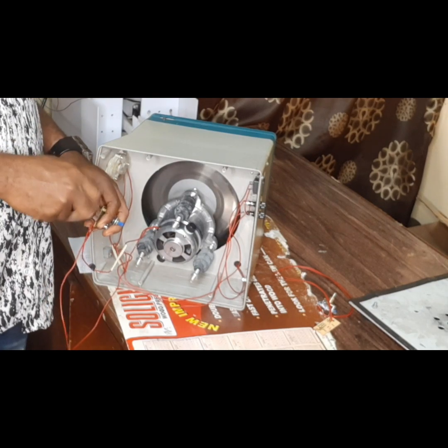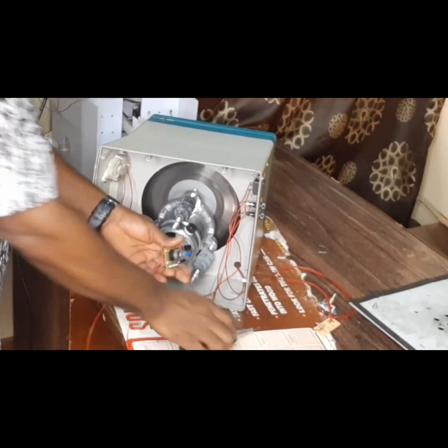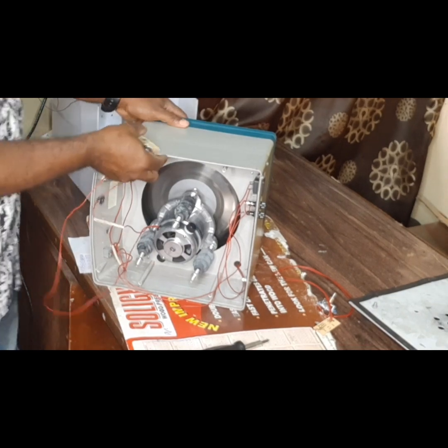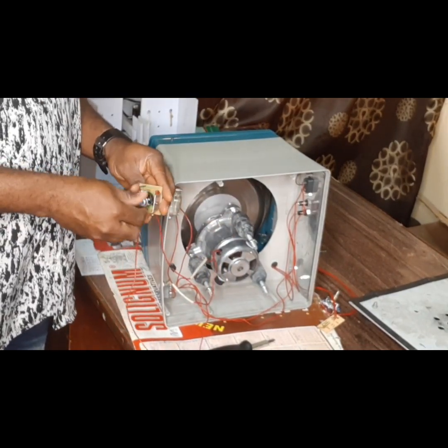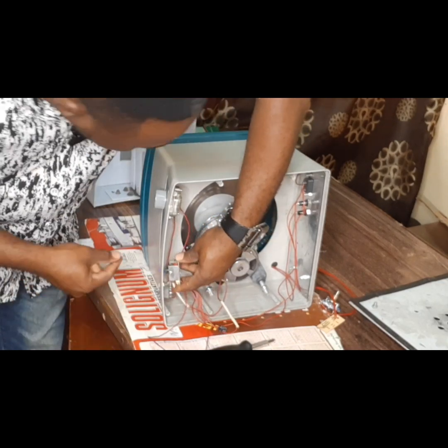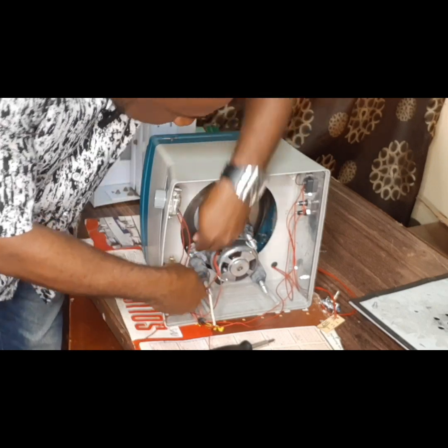Then I will tighten it. Having done that, having locked this very well, what we are going to do is to attach it to the body of the machine. There's a provision, there's a position for it here.